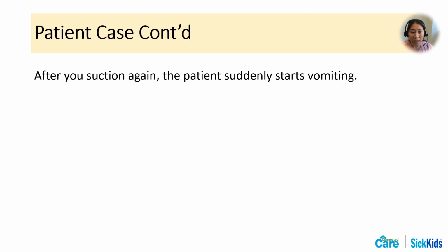After you suction again, the patient suddenly starts vomiting. Let's pause the video now and discuss what your next steps are. Great. We would roll the patient onto the side, oral suction, and clear the mouth. Allow the patient to recover. Always do your post-assessment and make sure the patient is at their baseline.